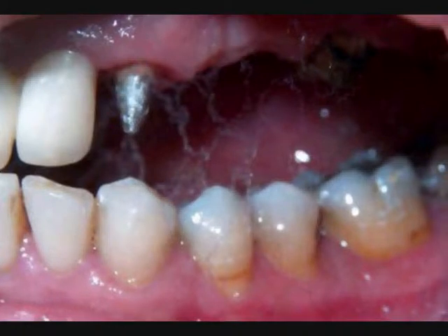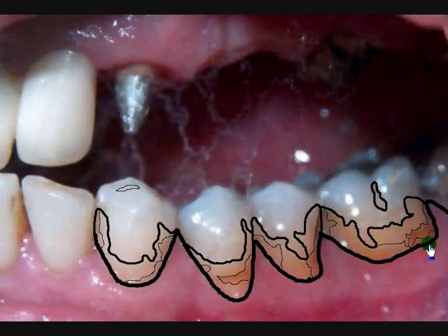So in this case, by drawing and contouring from the gingival attachment of the crown up to where I see the body color blend in with the enamels, I draw with a program like Paint and delimit these two areas, and divide the enamels from the body with just a drawing program. And in this case, it's as simple as that. This has been done and now applied.